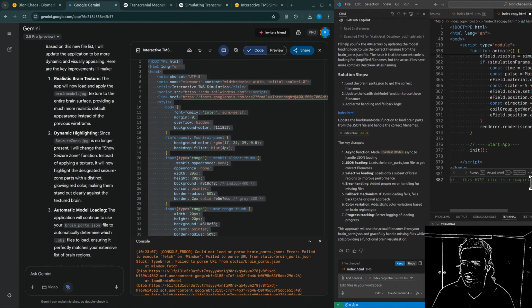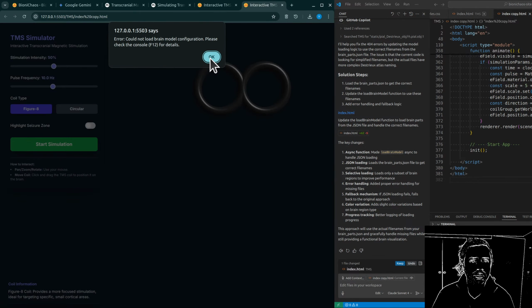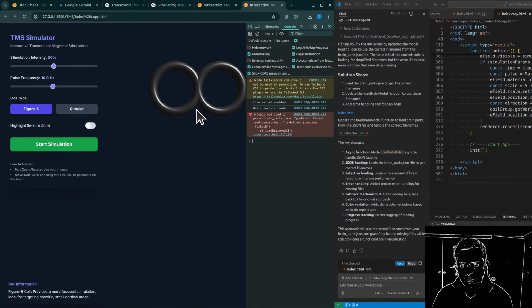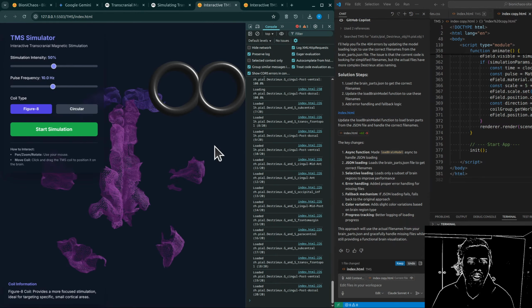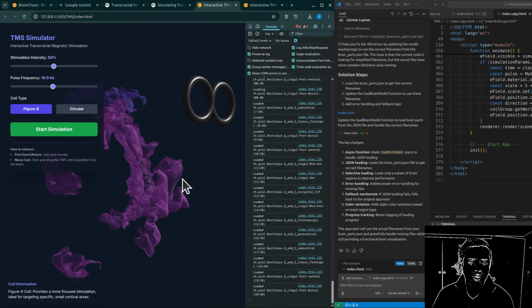And what's really neat, the sources mention, is that if clinicians use neuronavigation systems for placement accuracy in a real TMS session, like those GPS systems for the brain, kind of, yeah. The coordinates recorded by those systems can often be directly imported into the simulation software. Oh, that's a great link. Connecting the simulation directly to the clinical procedure. It really is. It helps ensure the simulation matches what was actually done.